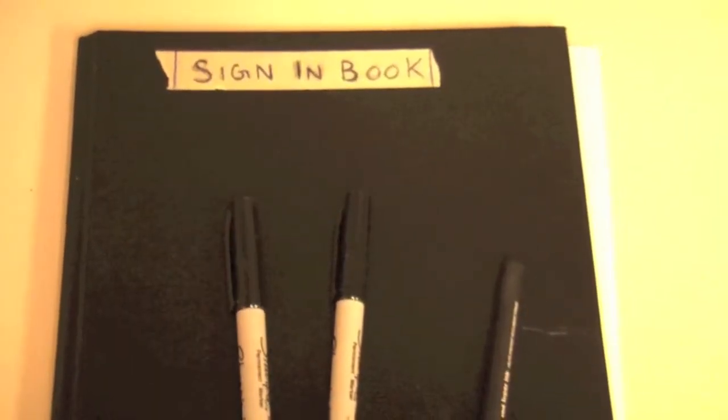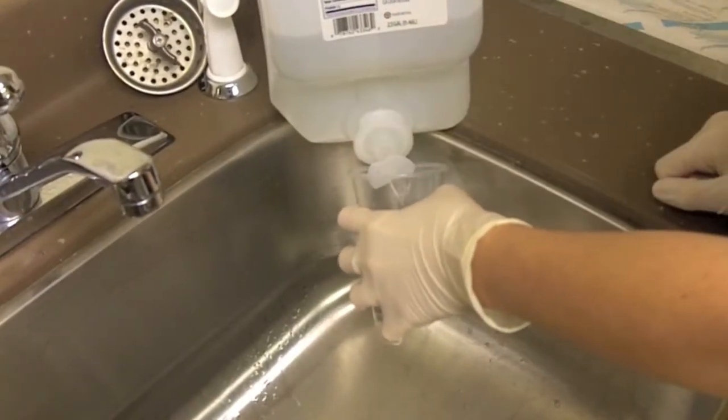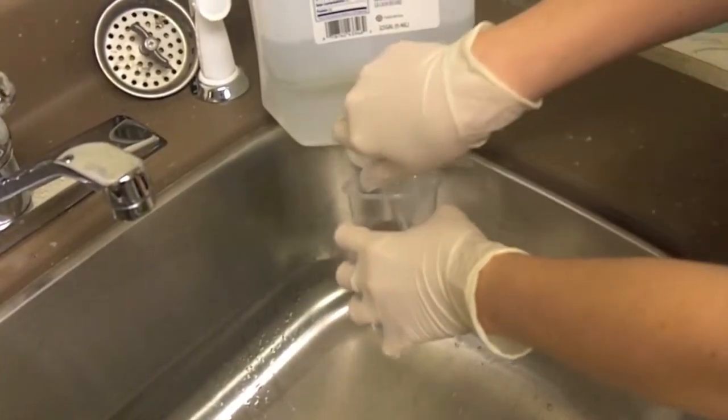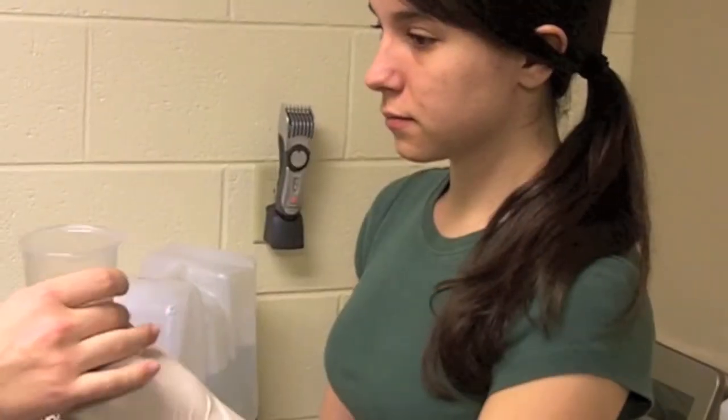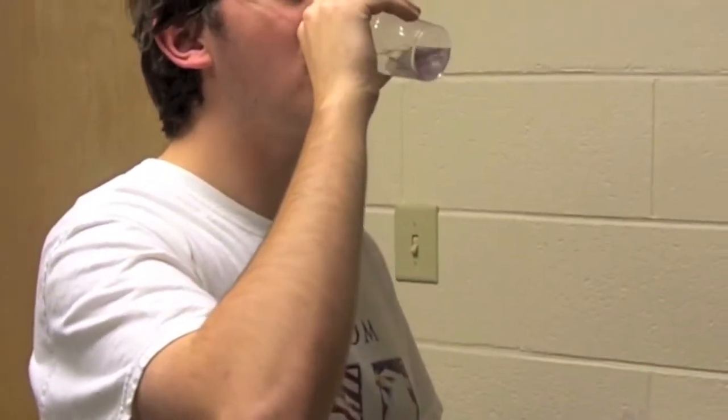Before collecting the first sample, all prescription and over-the-counter medications should be documented in the sign-in book. Each participant should be instructed to rinse their mouth with a cup of distilled water. At this point, the participant should avoid eating or drinking anything for the remainder of the session. This should be done approximately 10 minutes prior to saliva collection.